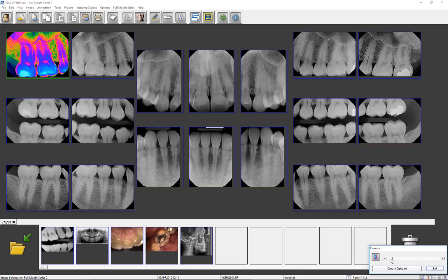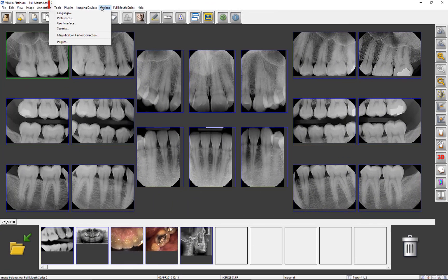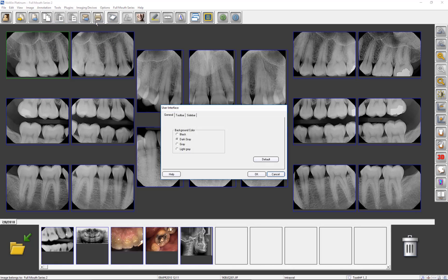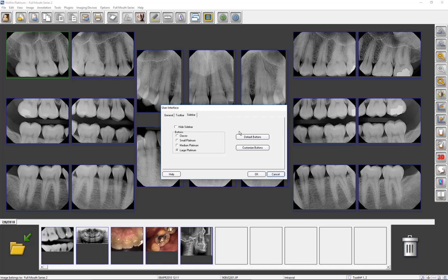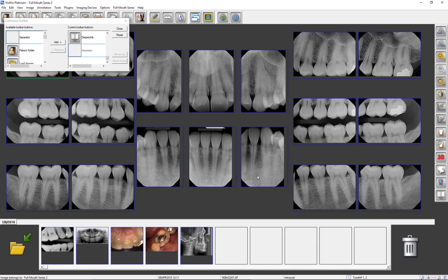You may use the Colorize dialog window to change the color profile as well as to copy the image to the clipboard to paste into a document. The sidebar can be edited by clicking on the Options tab of the menu bar, selecting User Interface, clicking on the sidebar, then on Customize Buttons. Here, tools can be added to the toolbar, taken away, and repositioned. For additional information, please view the Customizing the Workspace tutorial.